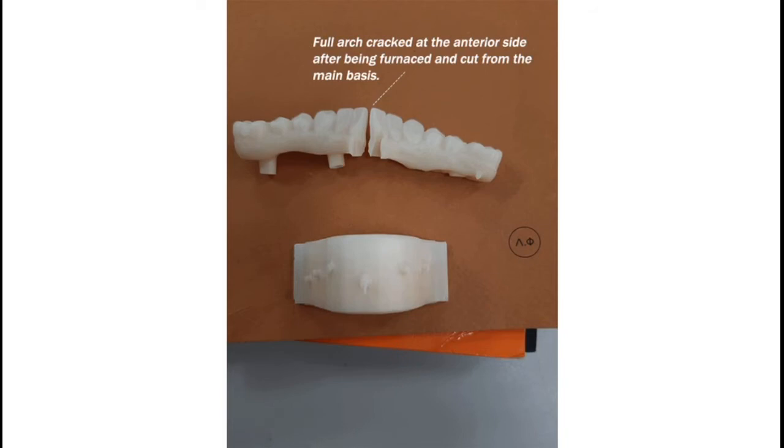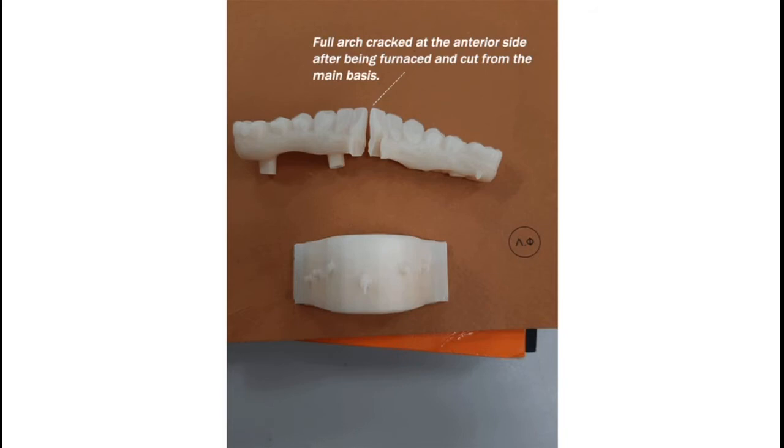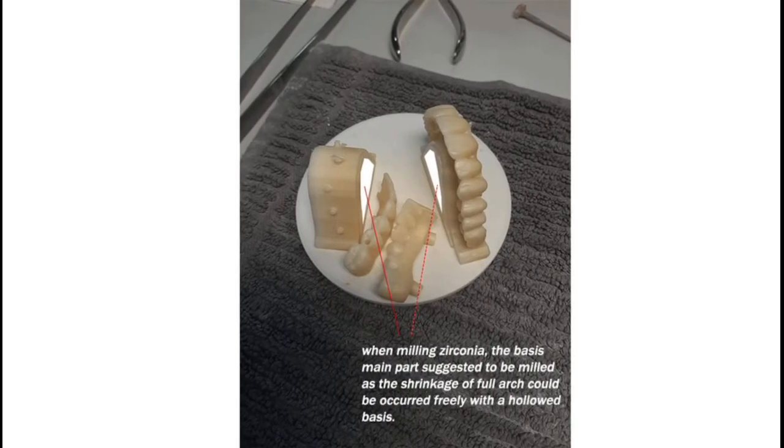Tip 2: Free shrinkage is the ideal trend for full-arch zirconia when it is being furnished. This means the less resistance encountered, the less chance of deformed shrinkage occurring.